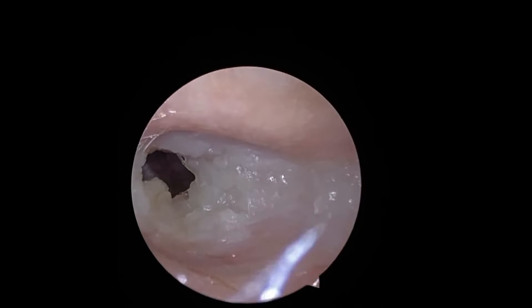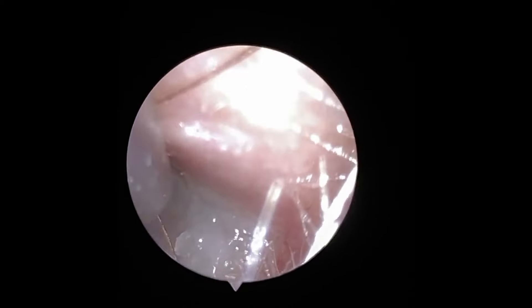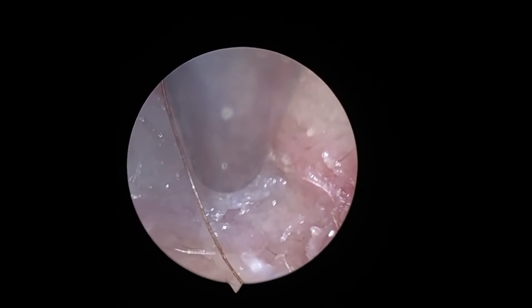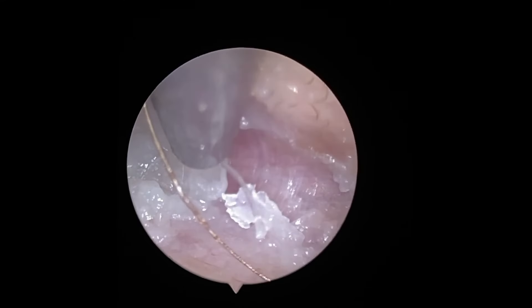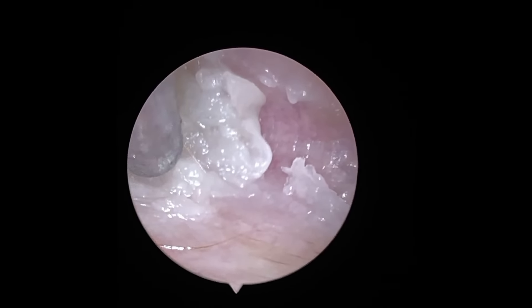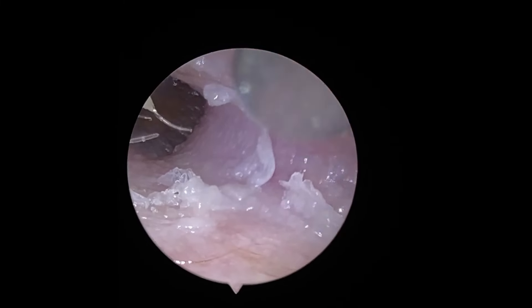Although this is white, it isn't an infection — it's almost just bleached out keratin, which gives it a wet look from the hydrogen peroxide still in the ear, because hearing aids have been worn on top of this blockage. I get through the very thick tragus hairs and the white keratin blockage begins to come away very easily. Some areas being revealed underneath are very pink, which shows it was beginning to get sore through the overuse of the hydrogen peroxide, but on a follow-up appointment this pinkness had all gone.